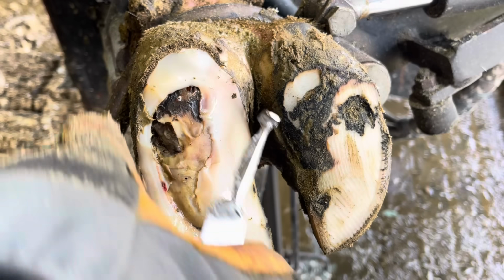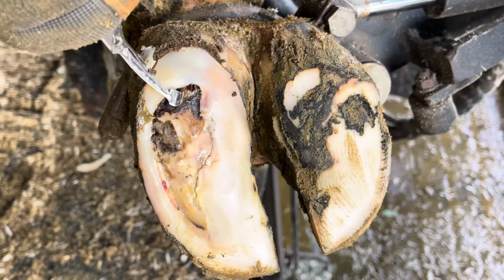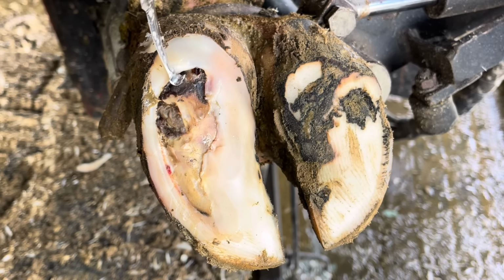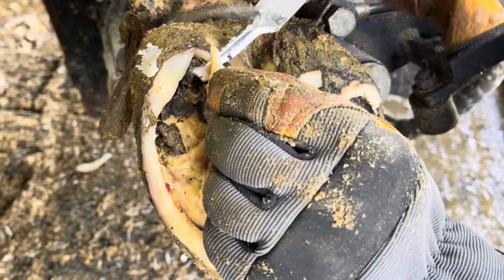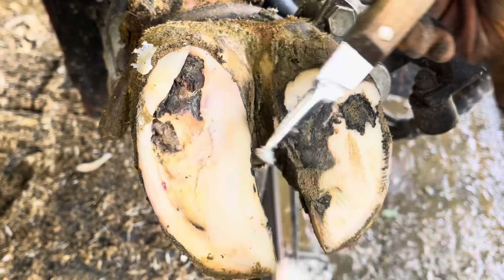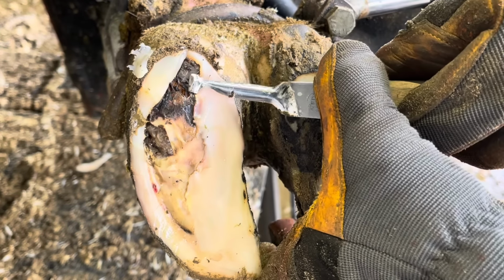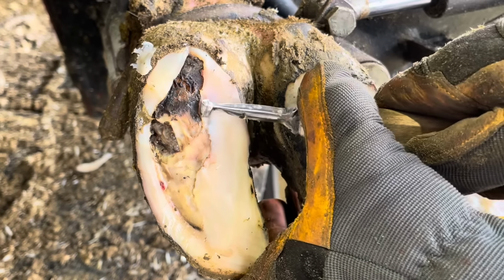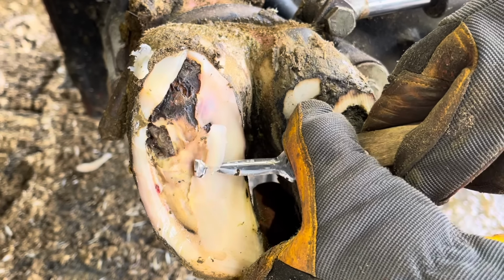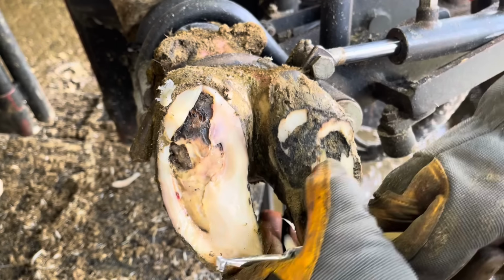Now, if you're wondering why I trimmed up into the heel bulb on this particular cow, it's because I know that that separation is going to go all the way up there. Typically, I'm not going to trim in that area. That's an area that's used for cushioning for that cow. It's not normal hoof horn that we would need to remove. That's actually like a shock absorber for the hoof. So I'm not going to typically trim up in there. But because I knew that this was separated and that that horn was loose, that's why I worked my way up there.